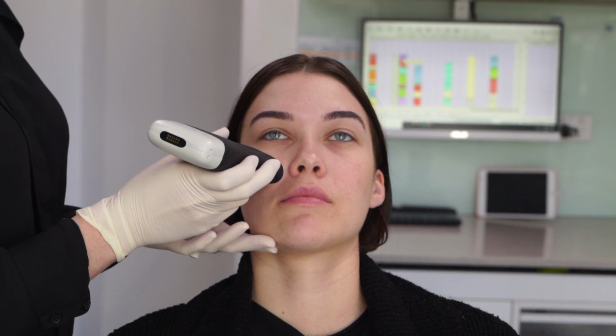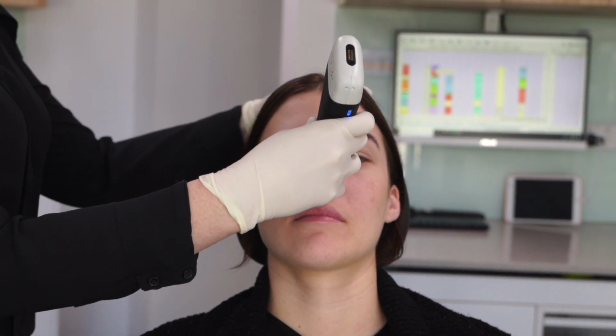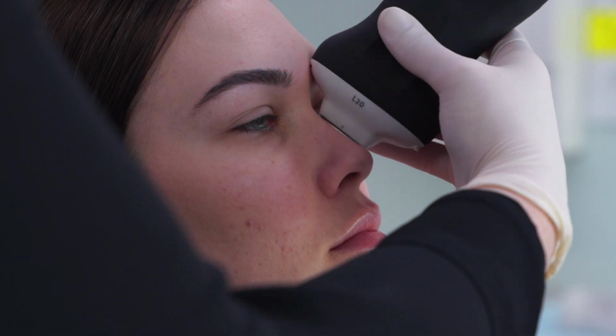In the midface, taking reference from the zygomaticus major muscle, you will slide from the zygoma towards the nose. In this position, the infraorbital artery will emerge from the infraorbital notch, whilst closer to the nose, the angular artery will appear. We can position the transducer to assess the nose by placing it sagittally and sliding up and down.